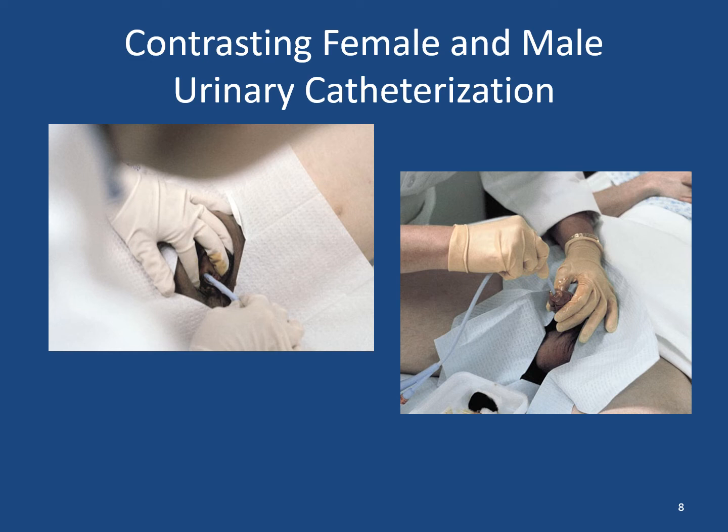It must remain stabilizing the site for the remainder of the procedure. If you remove your hand and let's say the labia close or the penis then touches the bed or touches a leg, touches anything, it is no longer sterile, and all that cleaning that you did is for naught. You've got to restart the whole thing with new gloves. So as soon as you plant that hand, you are one hand down.